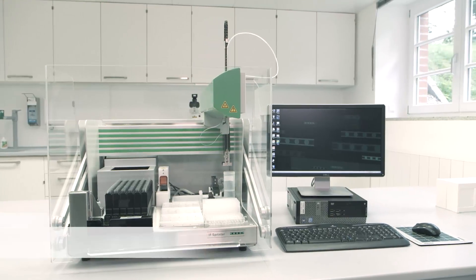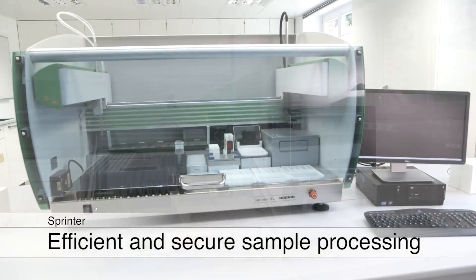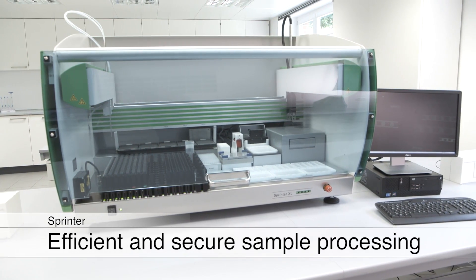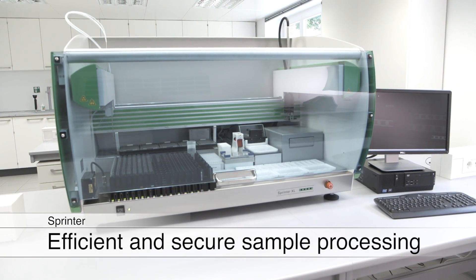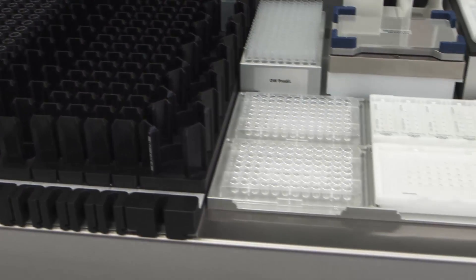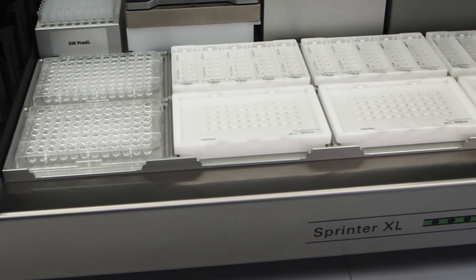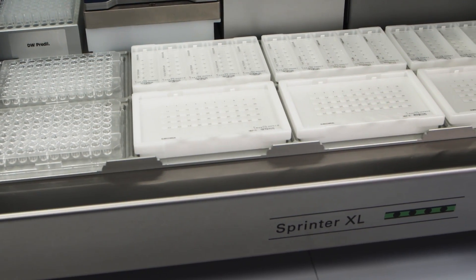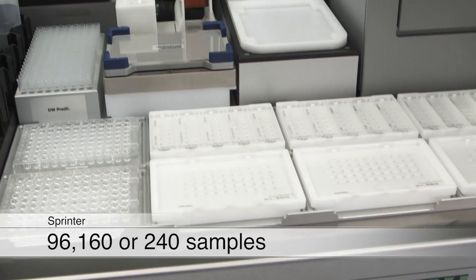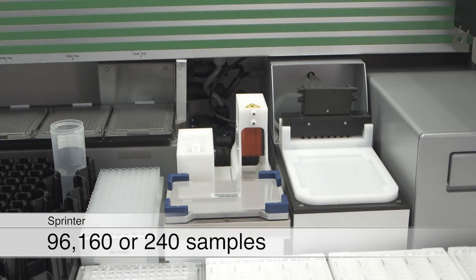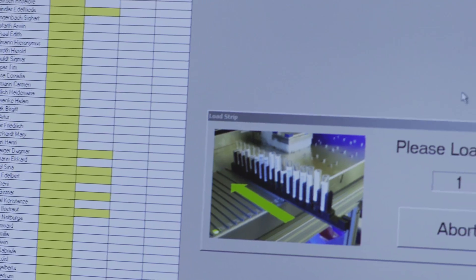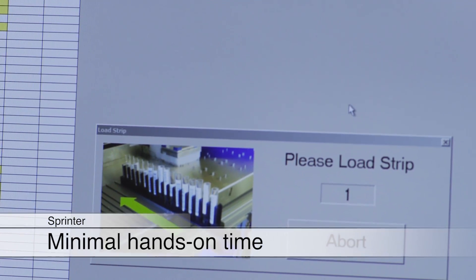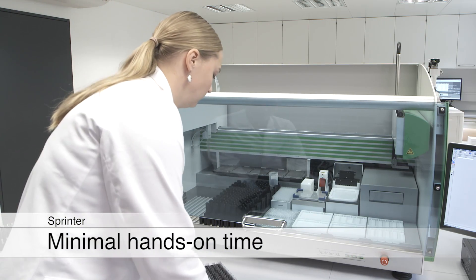The IF Sprinter and Sprinter XL are efficient and reliable systems for the automated processing of immunofluorescence tests. They can process 96, 160, or 240 samples in one run. Software handling and loading of the instruments is very easy and only requires minimal hands-on time.